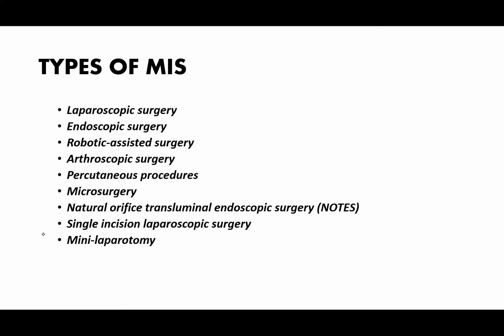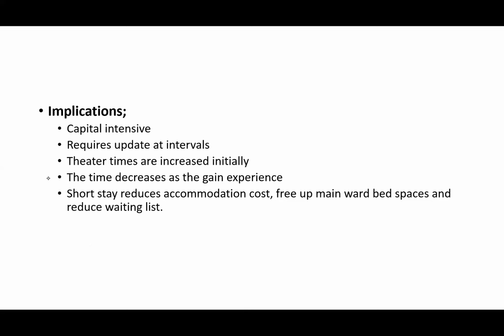Endoscopic surgeries, robotic assisted surgeries, arthroscopic surgeries, percutaneous procedures, microsurgeries, natural orifice transluminal endoscopic surgeries, single incision laparoscopic surgery and mini laparotomy. So these are the various types of minimal invasive surgeries.